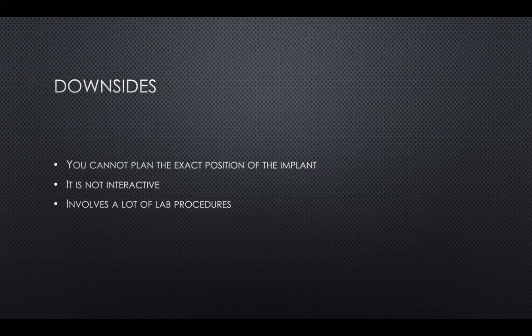And the other problem is that it involves a lot of lab procedures as well. But it's a reliable method to analyze how much bone you have and to guide you at least in the mesial-distal location of these implants. So it's better than freehand for sure.